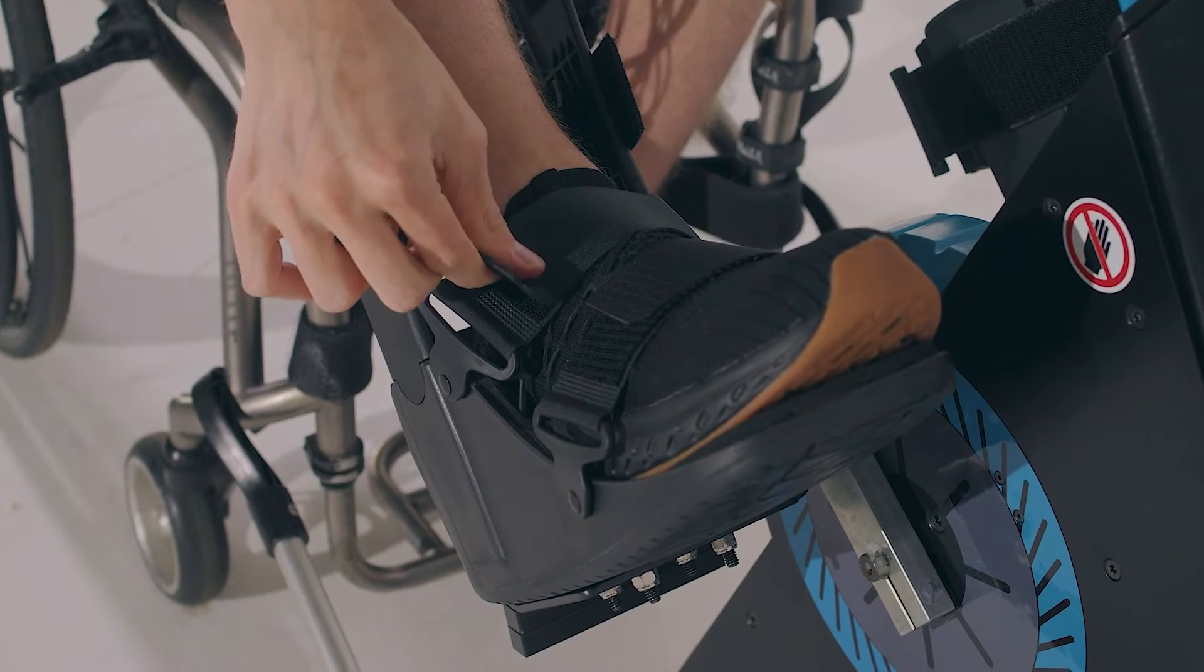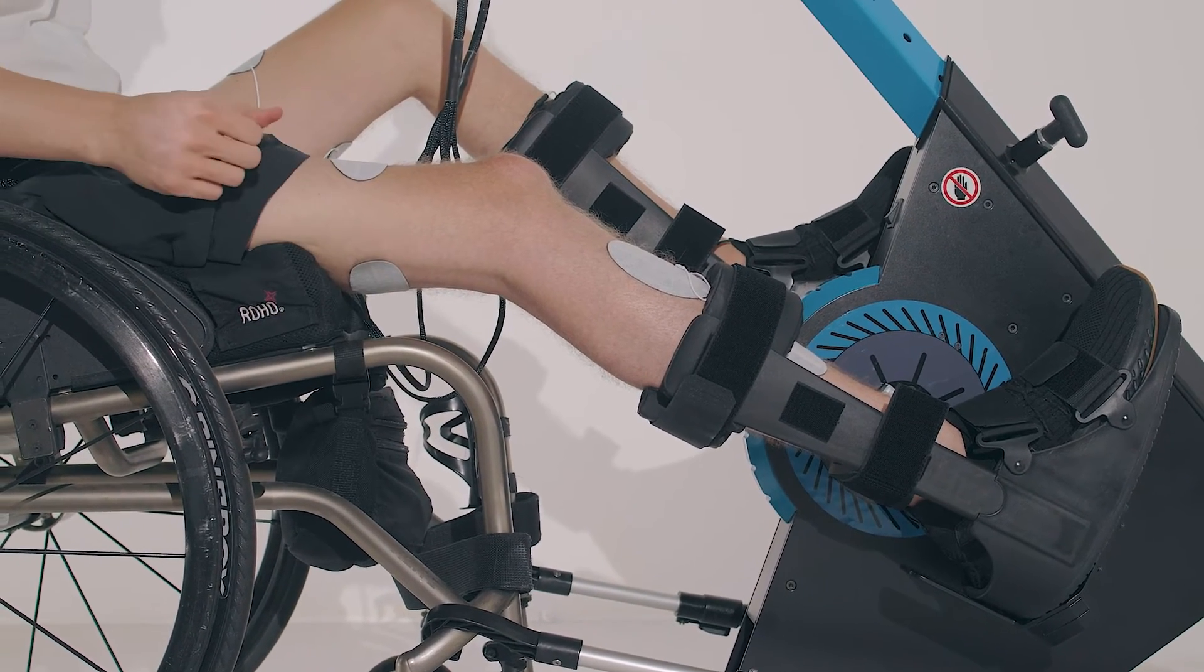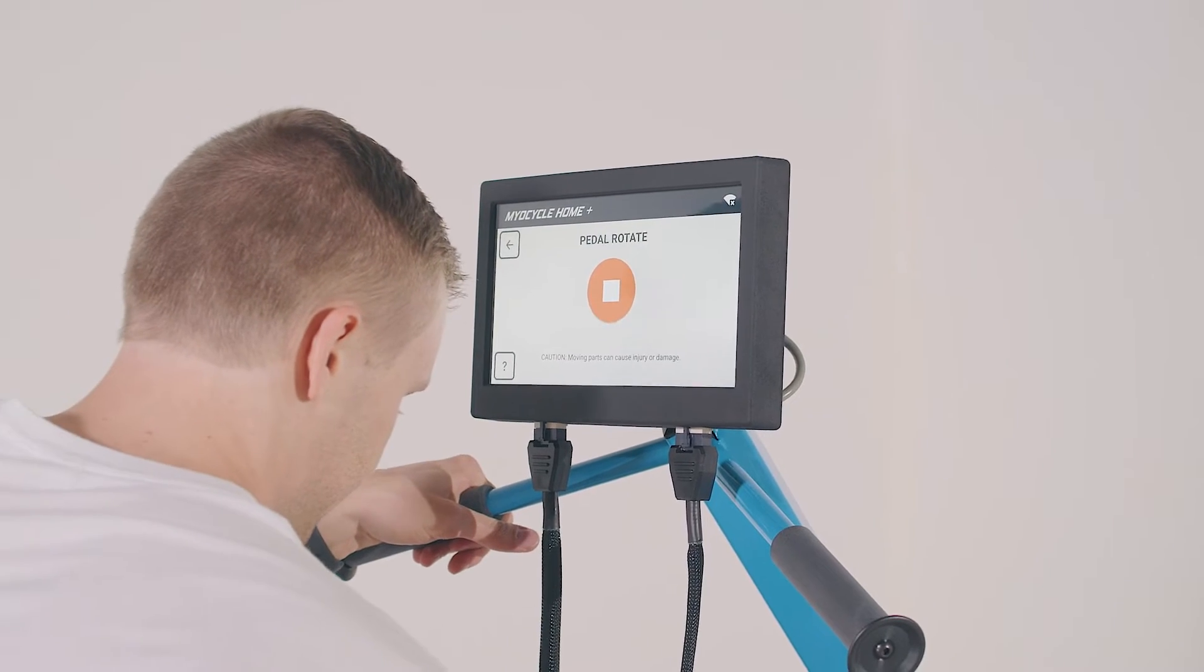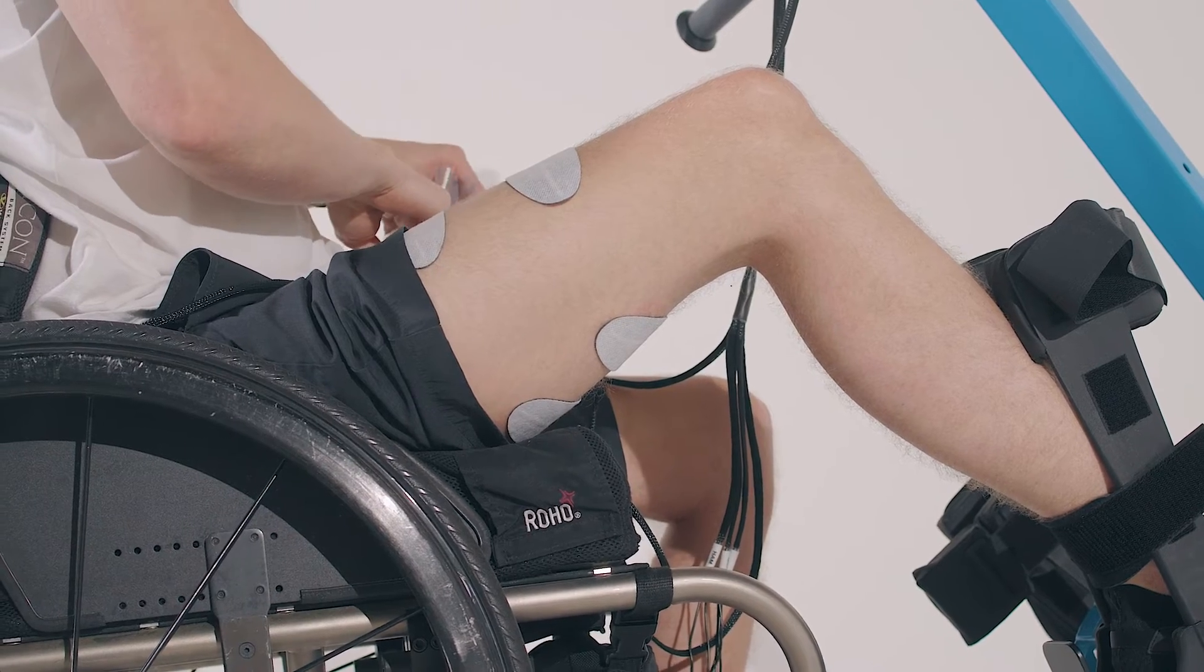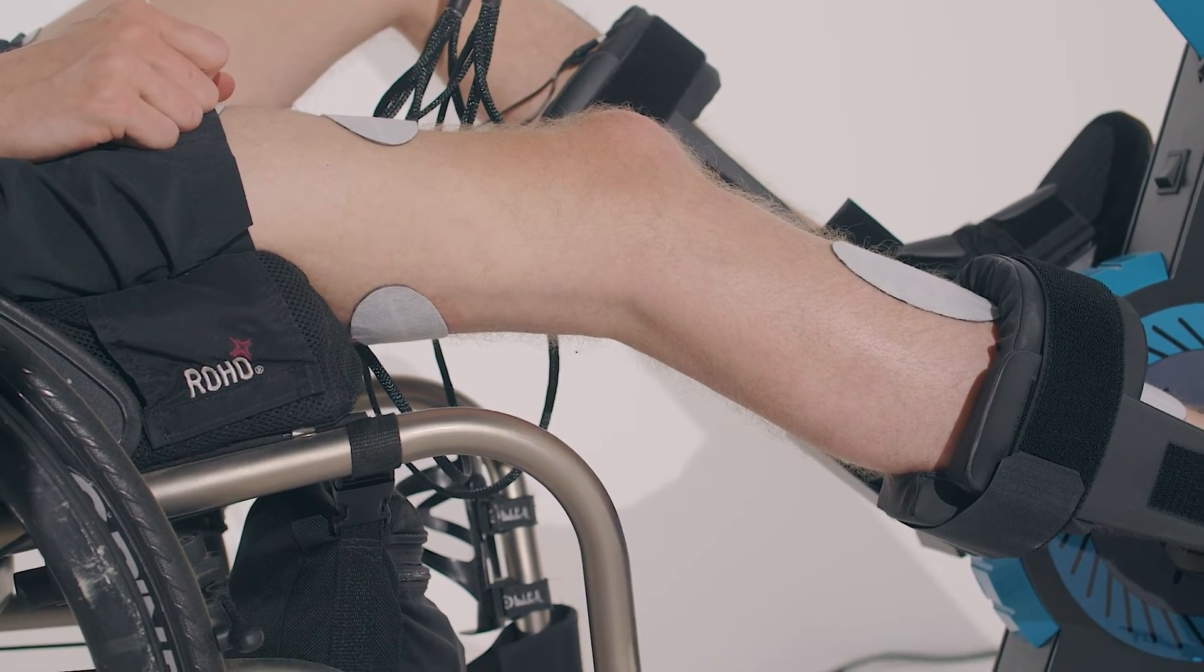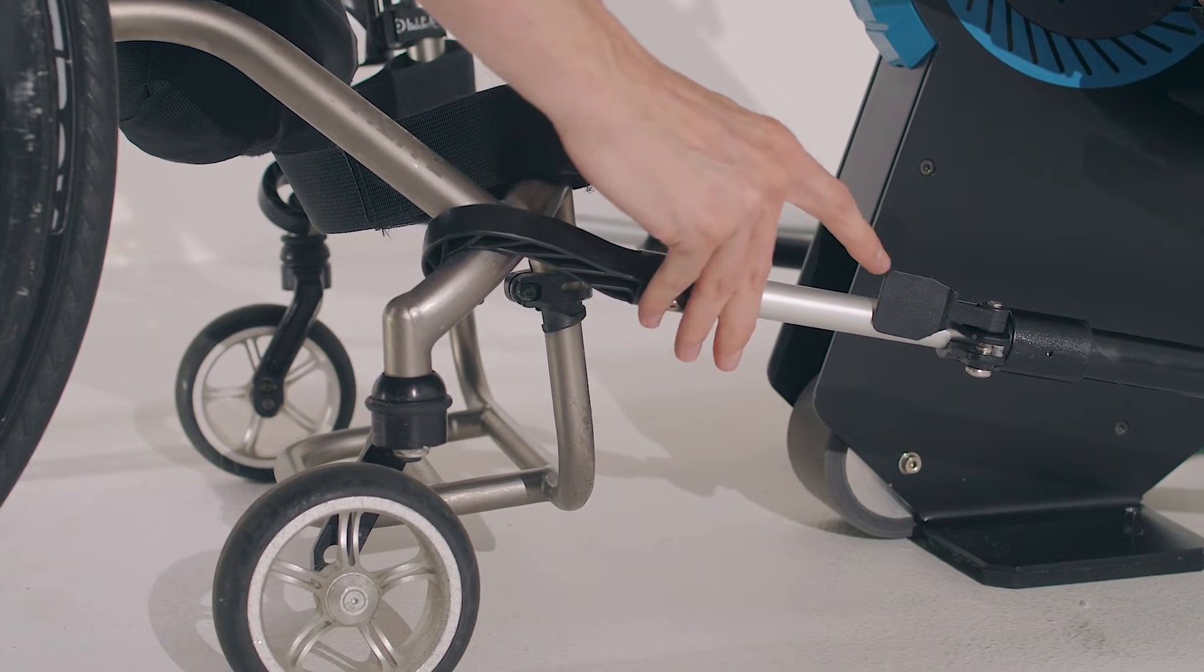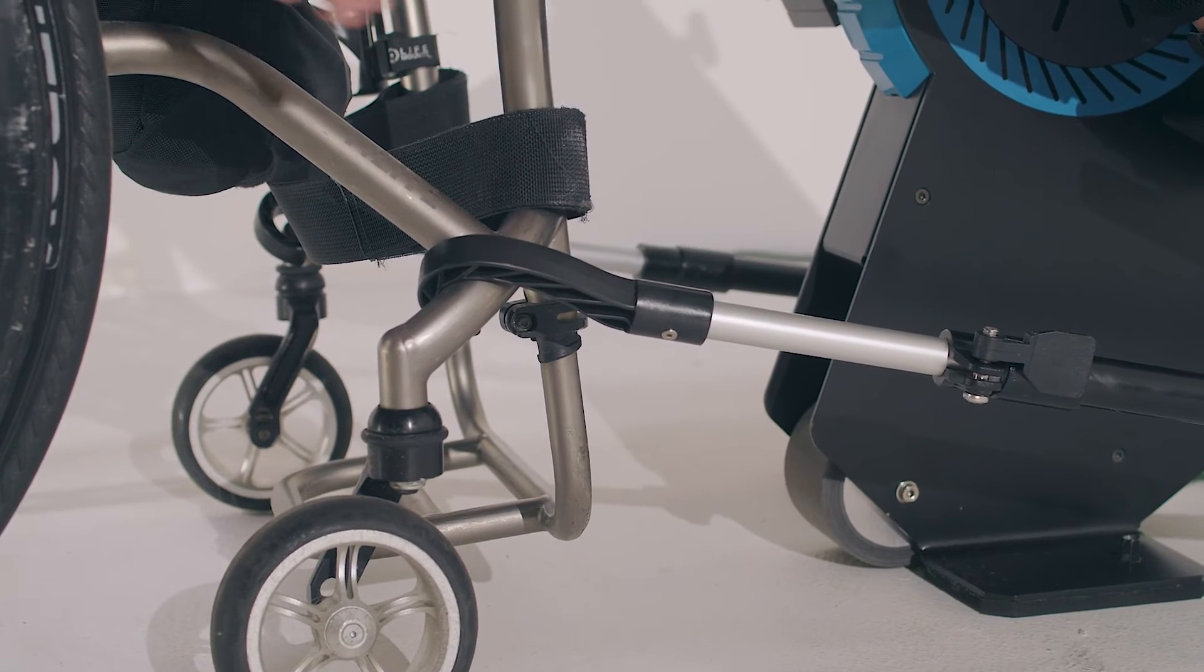Once your feet are secure in the pedals, double check that your chair is centered and that your brakes are locked. Use the rotate pedals feature to ensure that you maintain a slight bend in the knee at all times while cycling. Your knees should never be fully extended during a session. Once you're in position, use the chair attachments to lock your chair in place. The best place to secure the attachments may vary depending on your chair.